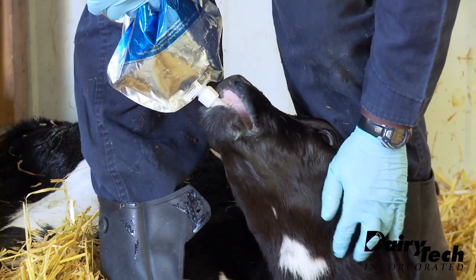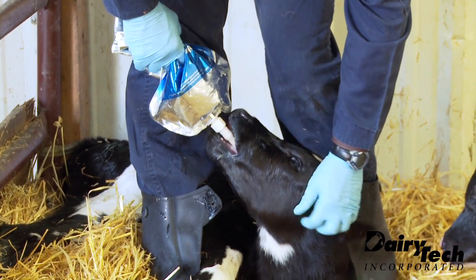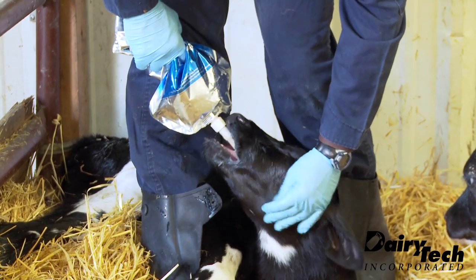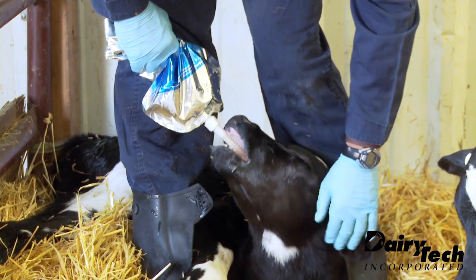It's important when we put the tube in and when we remove it that the bag be down lower than the tube, or that we kink the tube off so that there's no fluid flowing in as we're going in or coming out. That way we help prevent the calf from aspirating that colostrum into its lungs.